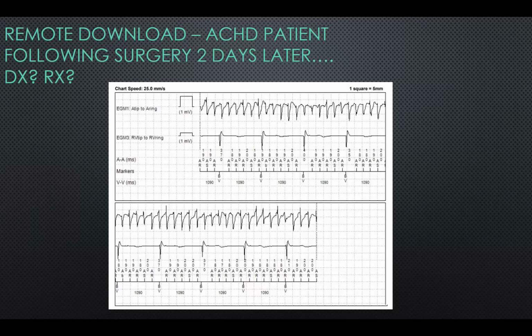Okay, so if you take this patient to the cath lab, how are you going to set up the defibrillator? I'm going to sync it. It's going to be a sync DC. To the A or the V? Sync to the V. That's correct. That's my favorite trick question. There's no way to sync a defibrillator to the A, and we wouldn't want to anyway, because the concern is putting an R on a T wave, of course.